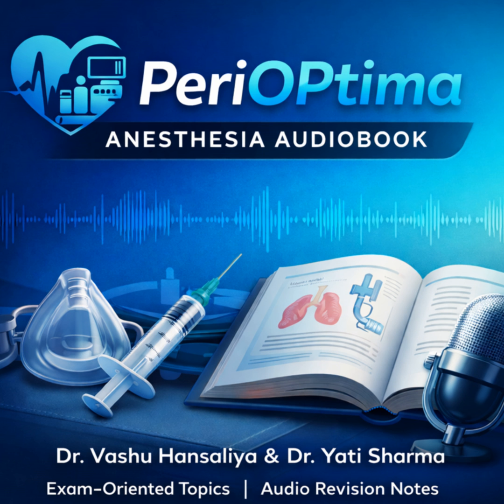And that's where the physiological oxygen reserve we talked about becomes the patient's lifeline. It's literally the buffer that keeps them alive while you fix the problem. And when our monitors fail us, like PETCO2 and one-lung ventilation, you have to revert to the gold standard, an arterial blood gas, an ABG, or at least a very, very careful interpretation of the pulse oximeter, knowing its limitations. And beyond the patient, this all comes back to staff health, too. Right. A functioning scavenging system is the only thing protecting the staff from the same kinds of risks our patients face, just over a much longer time frame.